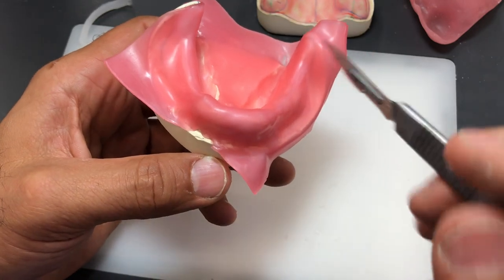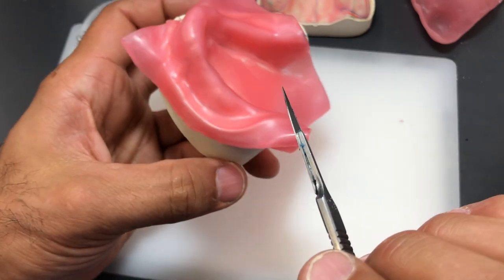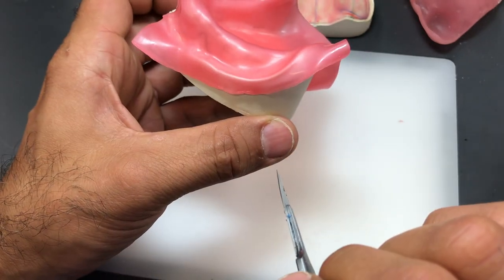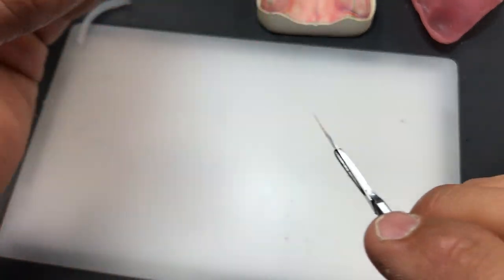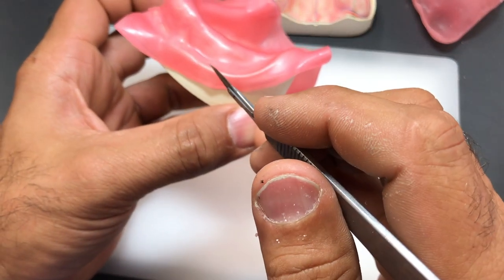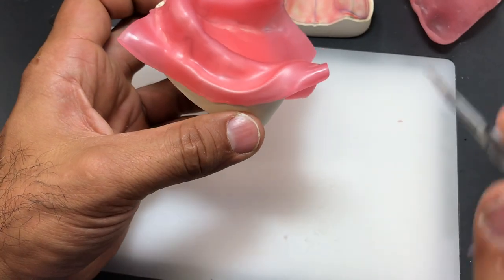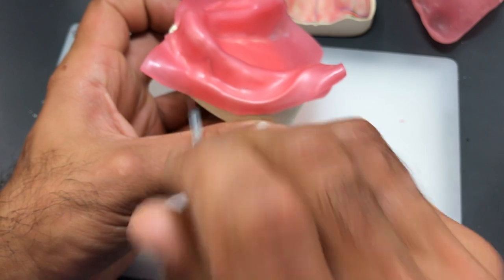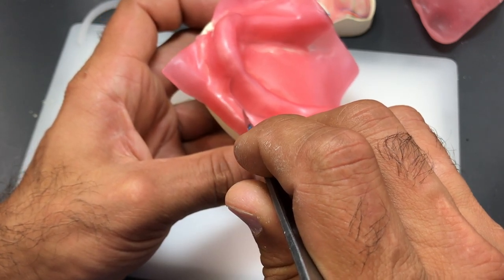So now we're going to take our surgical knife and cut this wax right to the line. And again, the importance of having a heavy outline and cutting it back right to the line. Just like before, I'm holding the model, but my right side now comes in to cut the wax, I'm anchored to my left side, whether it's using your last finger or your third or fourth finger. And I'm going to hold it in a way, and this is very important, that you cut the wax at right angles to the surface of the cast.